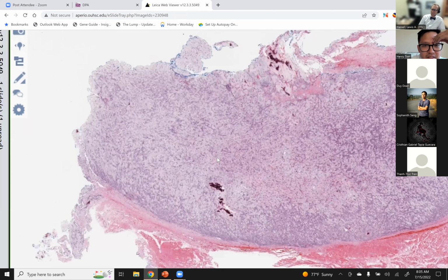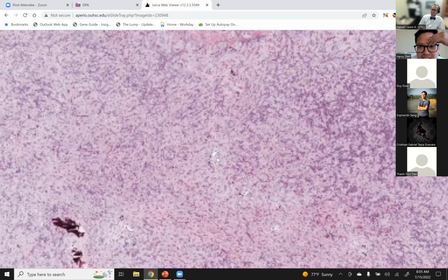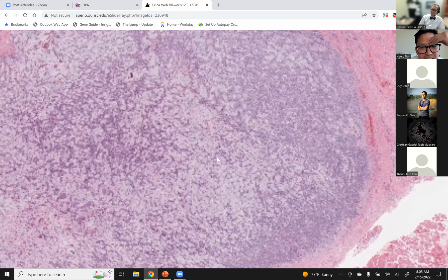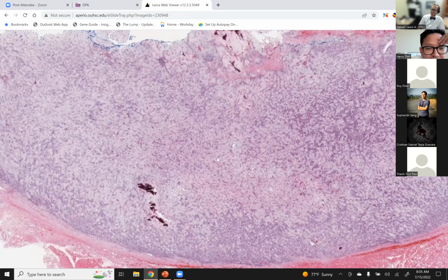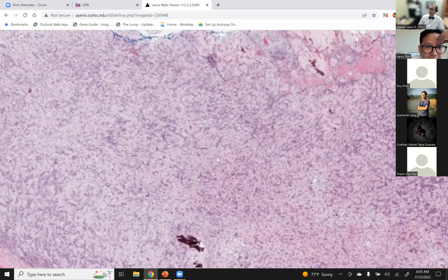Let's see. Hopefully the resolution kicks in. Maybe. Still super pixelated for me.